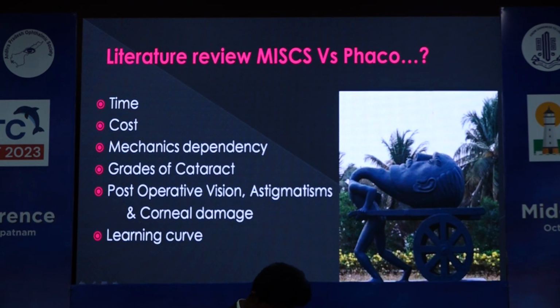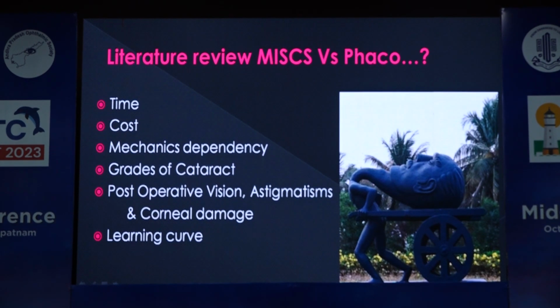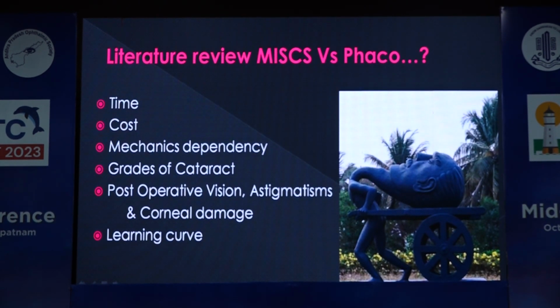So what is the option? The surgical management, which is the complete way to get rid of it, is cataract surgery. The two major ways by which the majority of cataract surgery is done and globally accepted are SICS and Phaco.